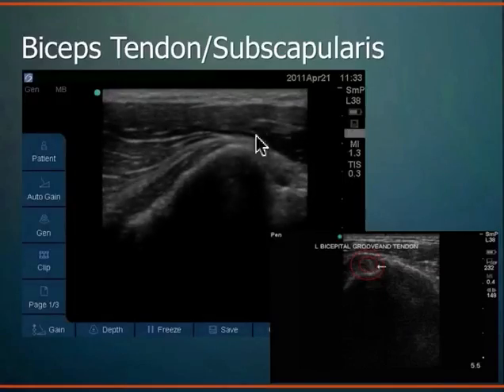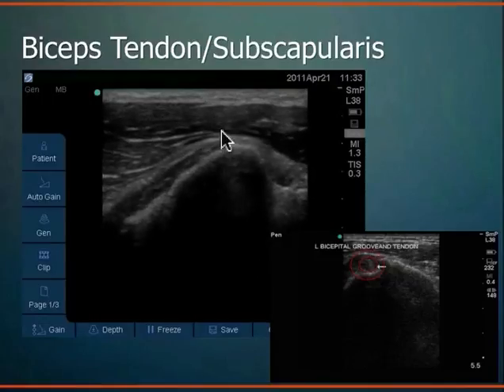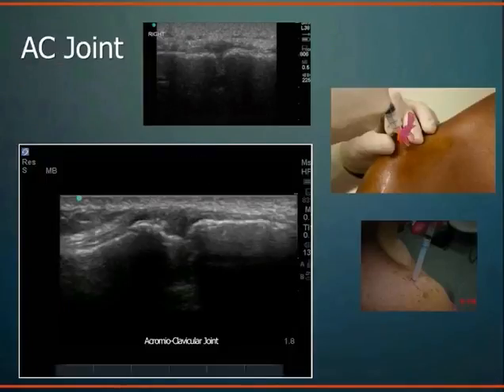And this is just the humeral head going into external internal rotation. And as it comes into external rotation, you can see the subscapularis coming across the top. So very easily imaged rotator cuff tendons on this modality, and you can see it quite well.